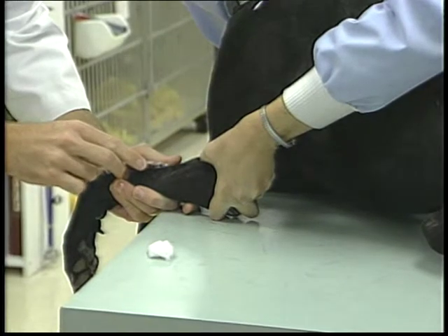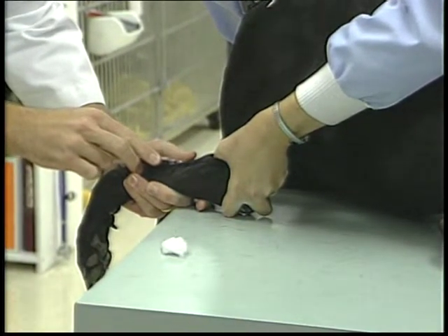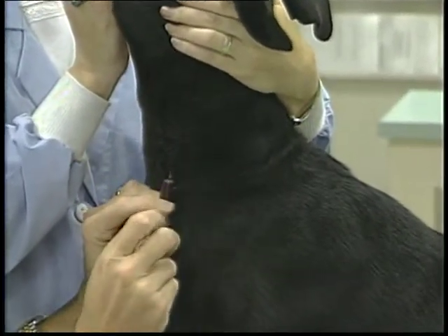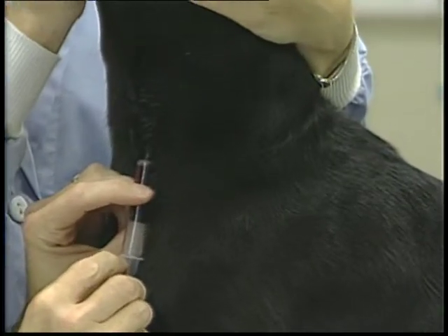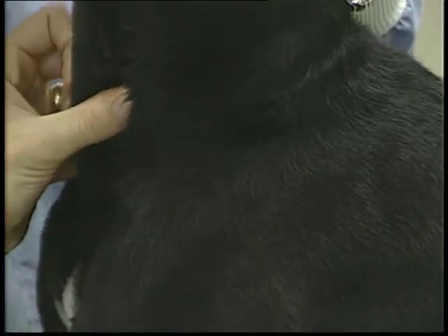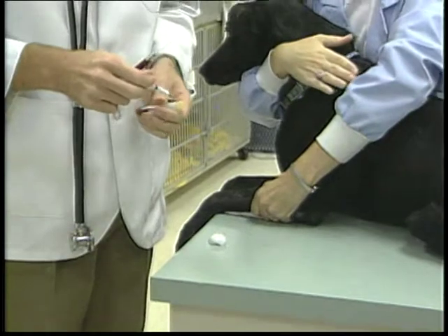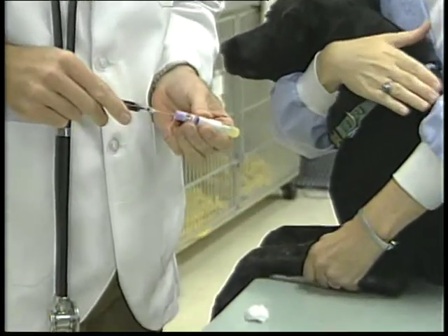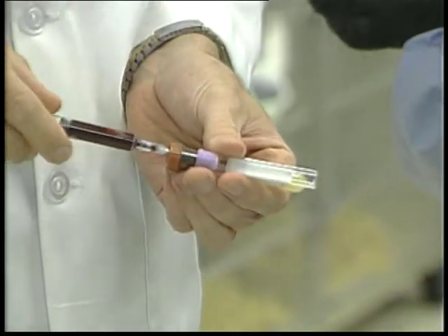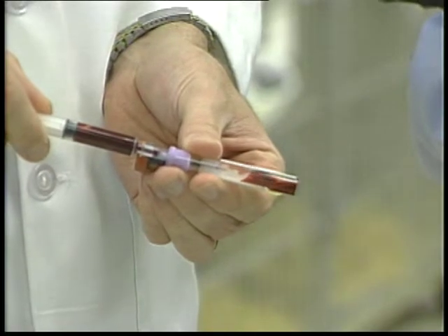In most dogs and cats, blood is collected from one of several veins. The cephalic vein on the leg is used when small amounts are needed, and the jugular vein on the neck is commonly used when larger samples are needed. This blood is collected into a sterile syringe and immediately deposited into one or more blood tubes called vacutainers. These vacutainers, as the name implies, contain a vacuum that sucks the blood into the tube once the syringe penetrates the stopper. The color of the rubber stopper provides a quick means of identifying if any added chemicals are present in the tube.